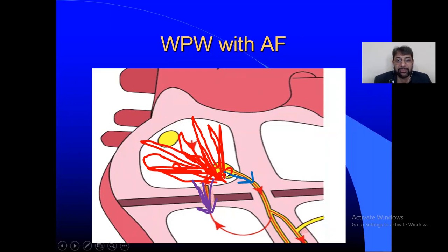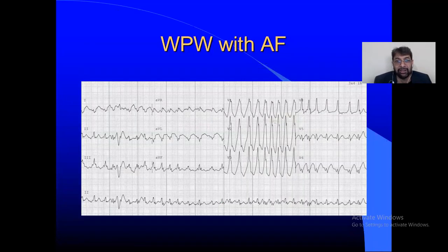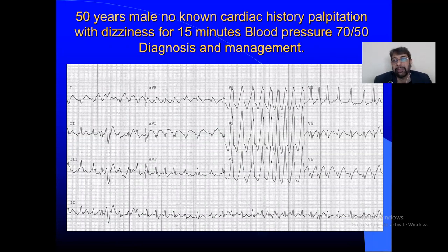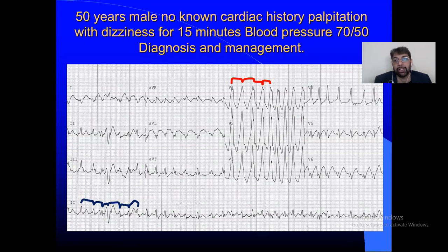In AF with WPW, many complexes arising within the atria find their way through either the AV node or the accessory conduction pathway into the ventricle. That's why you get a mixed QRS complex — sometimes narrow, sometimes broad, sometimes a combination. This is the characteristic ECG of AF with WPW. In conclusion, our patient had WPW with atrial fibrillation — the reason being irregularly irregular broad complex with beat-to-beat change in QRS morphology. Thank you very much for listening.